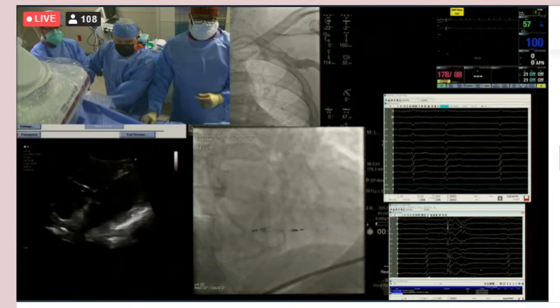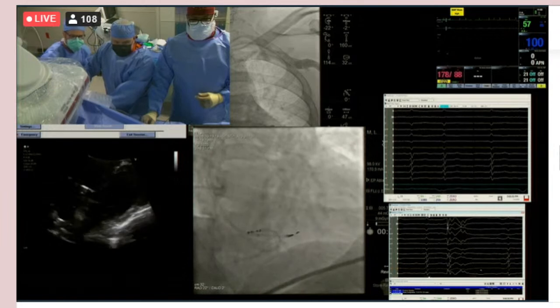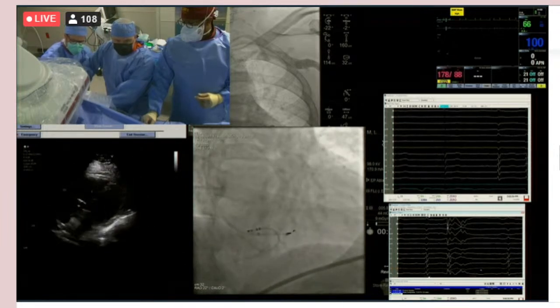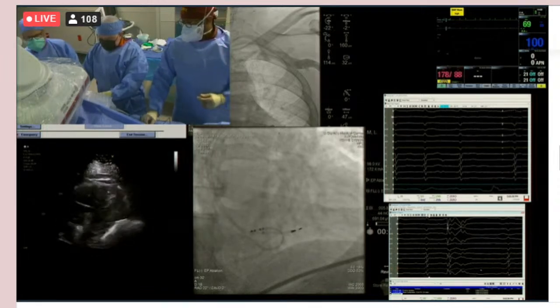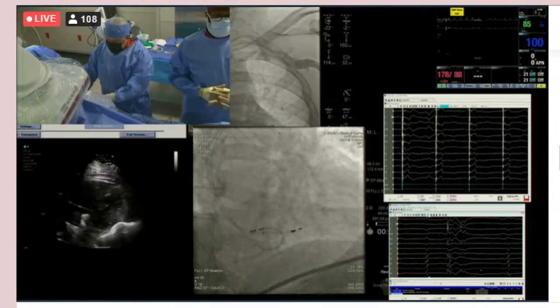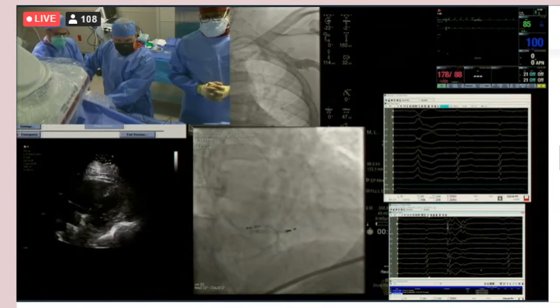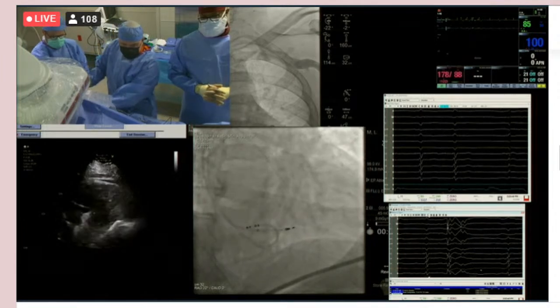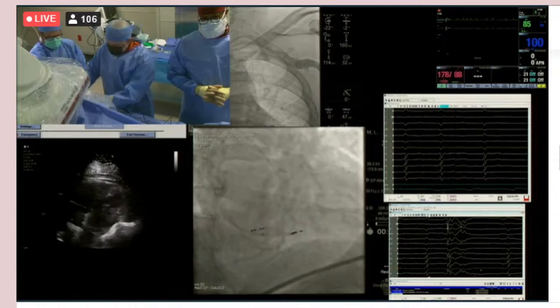And generally, if it doesn't start going in easily, you're not in the right spot because it should go in almost like butter. Got it. Now, a few other things that you'll see is as you're going, if it is in the right spot and it is getting deeper, the QS will change, and it'll still be a QS, but the S will become later and shallower.